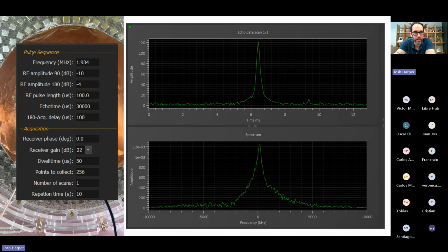And these are the spin echo imaging parameters that I used. Just a single scan, so I don't have to worry about my repetition time. But for water, it is quite long, and every day that I show Tom my data, he tells me that I need to switch to an oil phantom, which has a much faster repetition time, and I completely agree with him. So these are the results as they stand now.